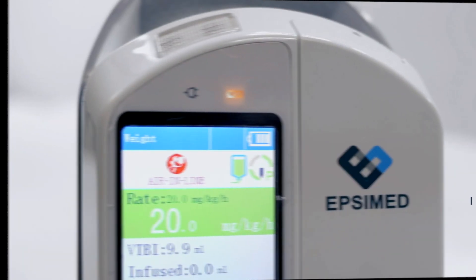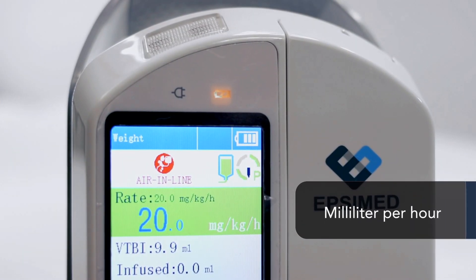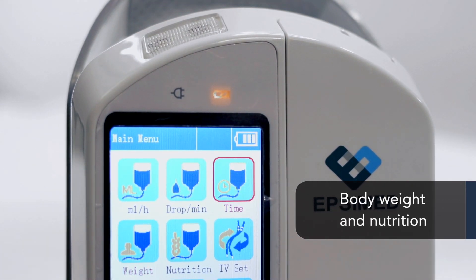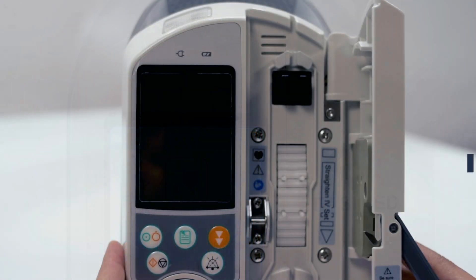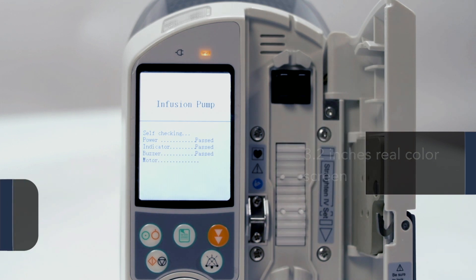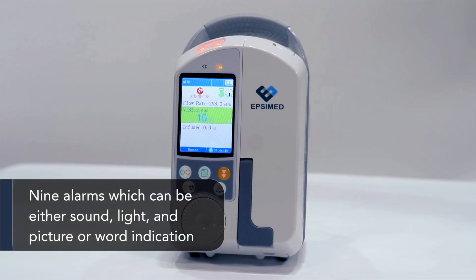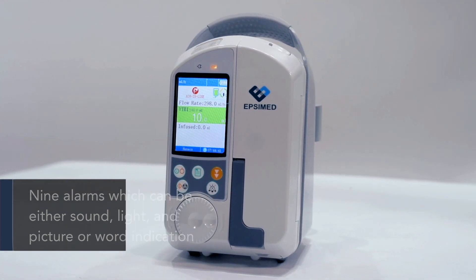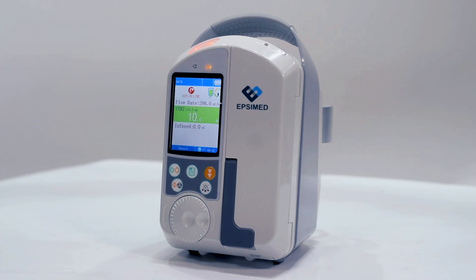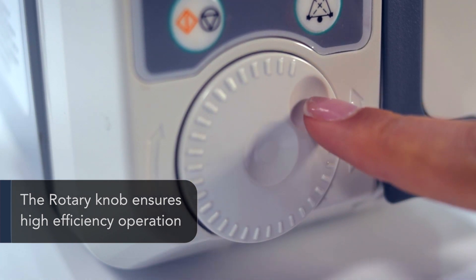The infusion modes are based on milliliter per hour, drop per minute, time-based, body weight, and nutrition. It features a 3.2-inch real color screen, up to 9 alarms which can be either sound, light, picture, or word indication. The rotary knob ensures high efficiency operation.